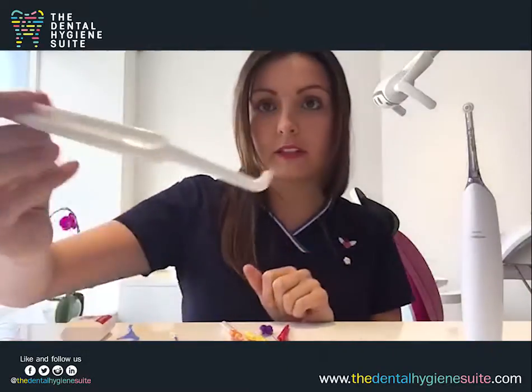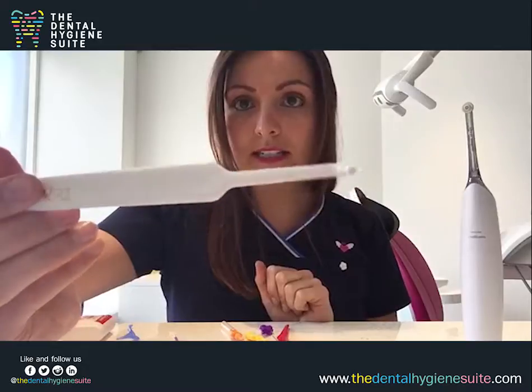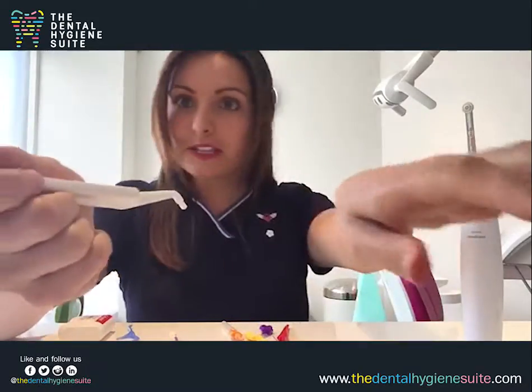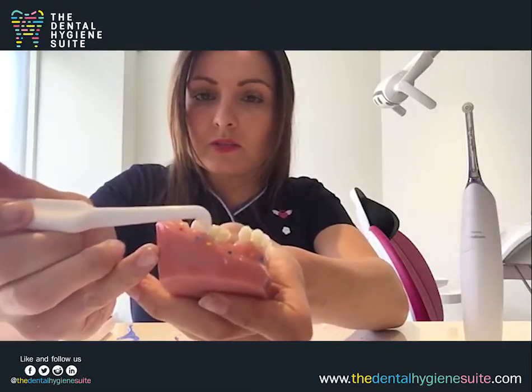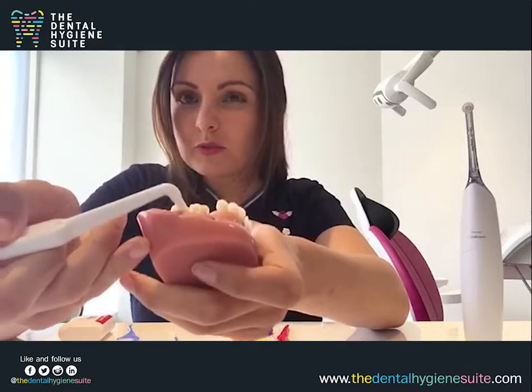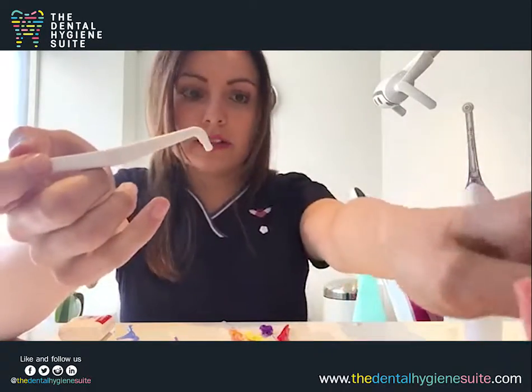Now, we've got these little tufted brushes. This is another option. Not the best thing to use, but if you're not using anything, it's sort of the next best thing. So just massage the gum and the gap in between, just really give it a good scrub, and I would come from both sides just because the bristles wouldn't reach all the way through otherwise.